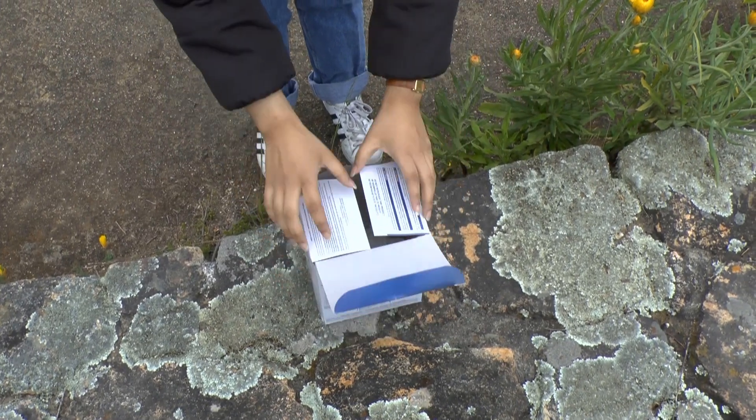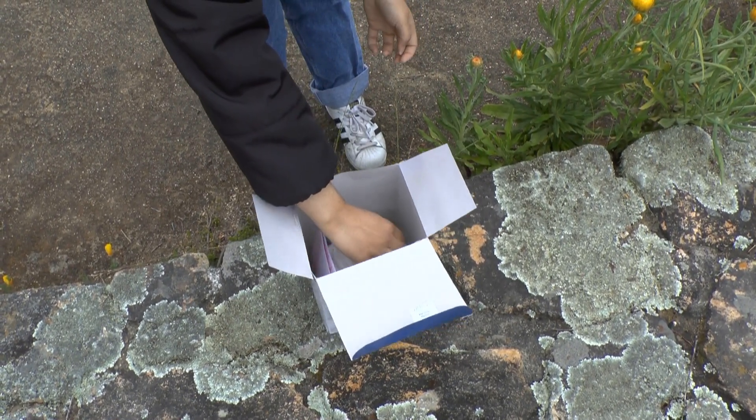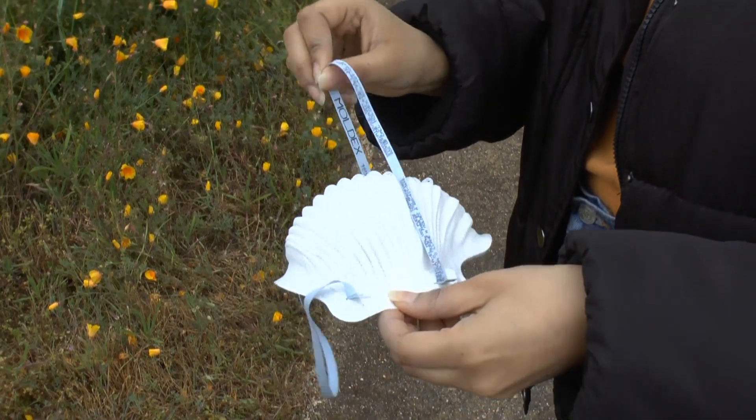Carefully remove the mask from its packaging. Inspect the respirator for damage or defect and make sure the elastic straps are not cracked.